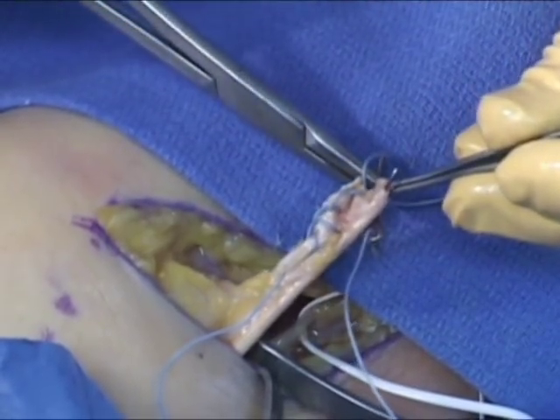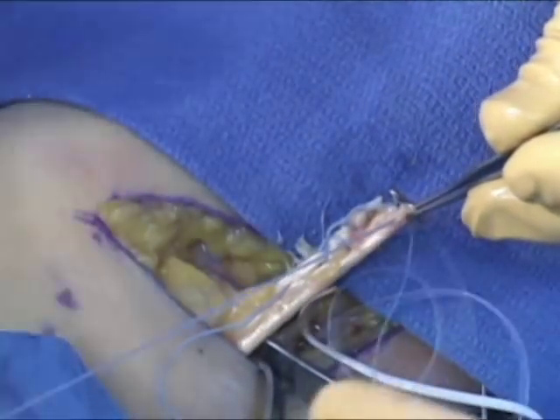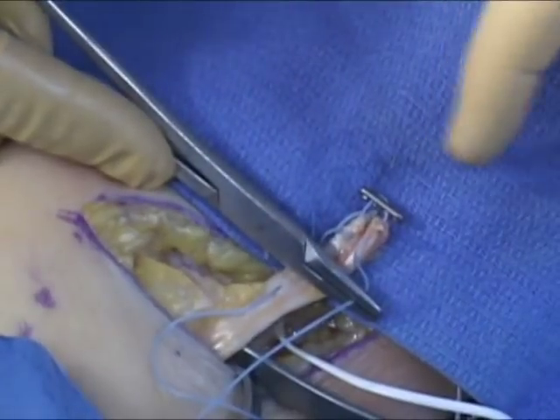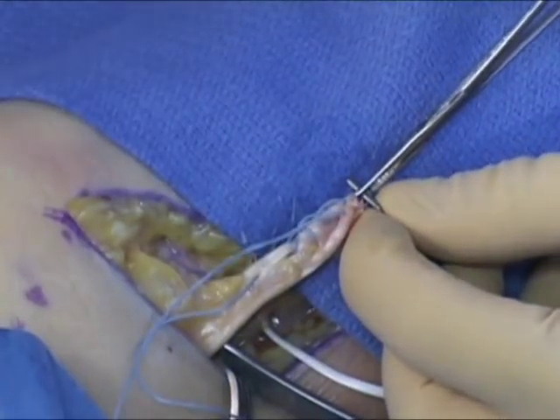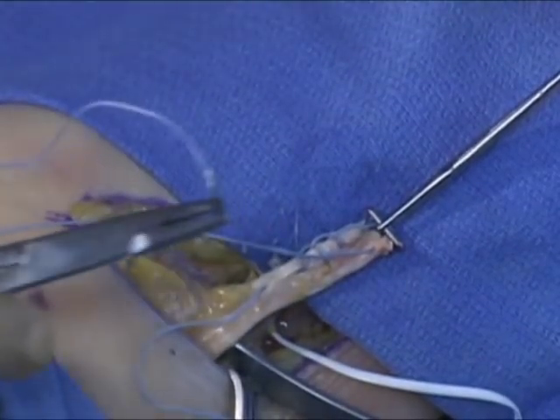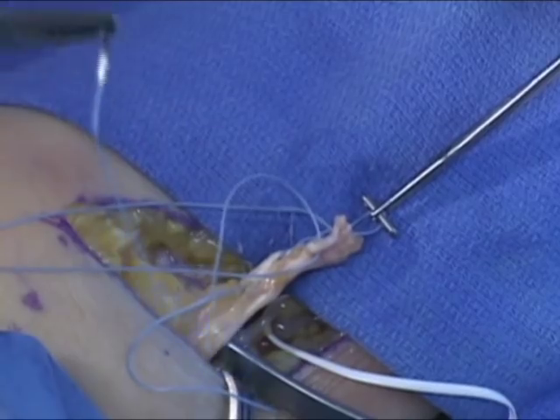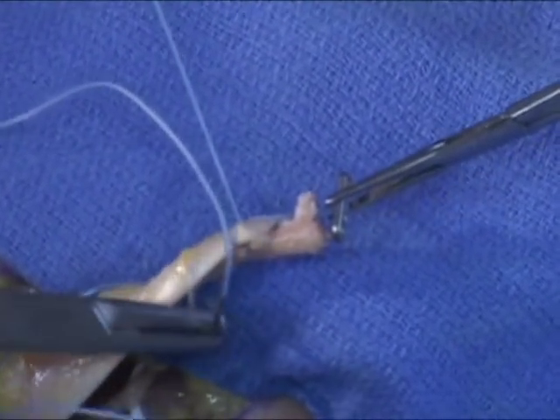The number five fiber wire suture is then carefully passed through the opposite end of the tendon. It is very important to set the tension appropriately on the endobutton. An assistant can hold the endobutton firmly while the suture is being passed. Approximately 5 mm of space should be left between the endobutton and the cut edge of the tendon. A lock of suture is then made, securing the endobutton at a 5 mm distance from the tendon end.